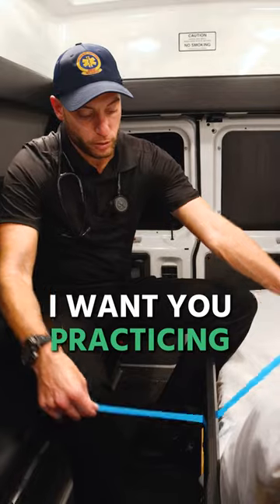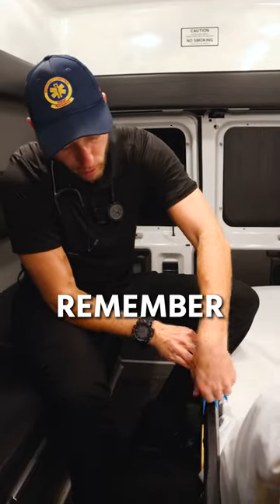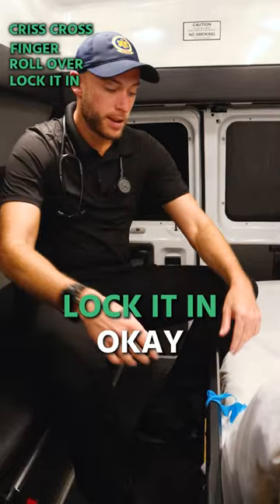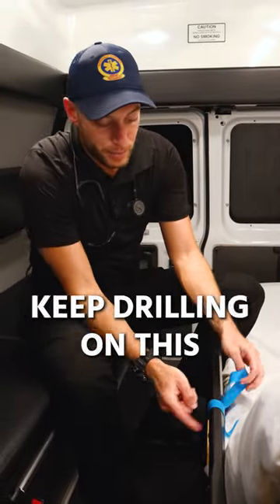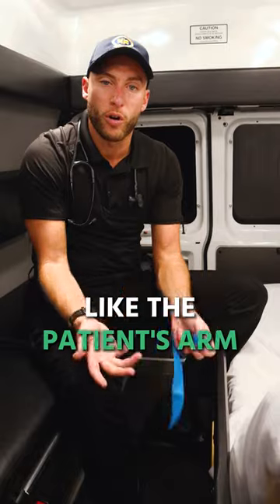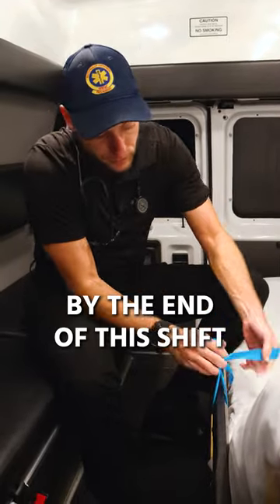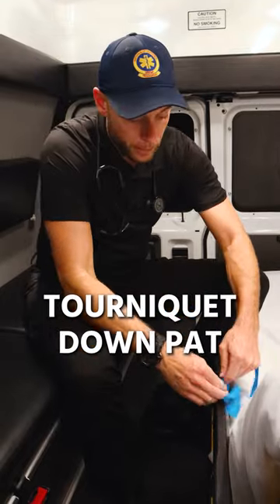What I want you doing is practicing your tourniquet on this bar. I'll show you here — crisscross, finger roll it over, lock it in. Now I want you to keep drilling on this. Pretend this bar is the patient's arm and just keep drilling and drilling. By the end of this shift, you will have your tourniquet down pat.